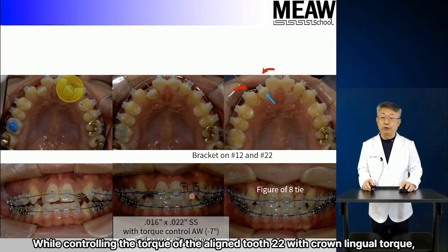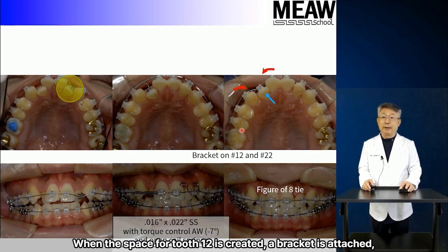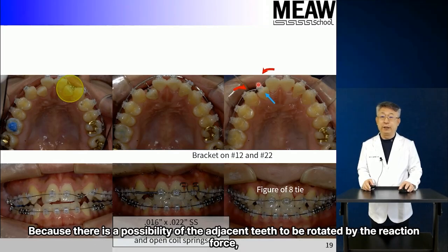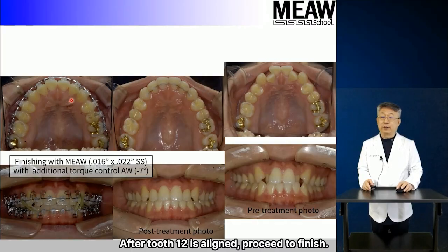While controlling the torque of the aligned tooth 22 with crown lingual torque, open coil spring is used in the tooth 12 area to create space. When the space for tooth 12 is created, a bracket is attached. And NiTi arch wire is inserted to align tooth 12 into a correct position. Because there is a possibility of the adjacent teeth being rotated by the reaction force, either use open coil spring to offset or tie teeth 11 and 12 with a figure of 8 tie. After tooth 12 is aligned, proceed to finish.